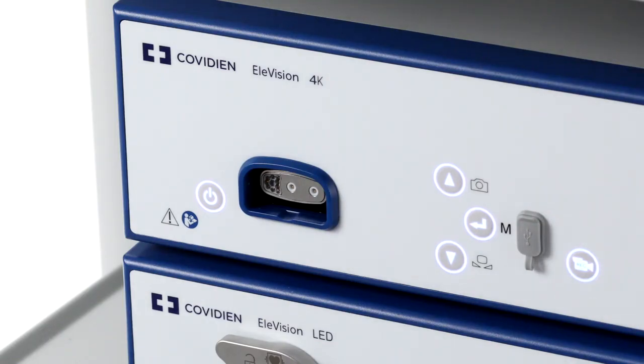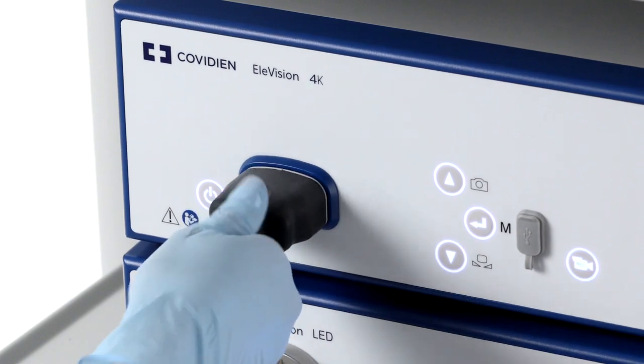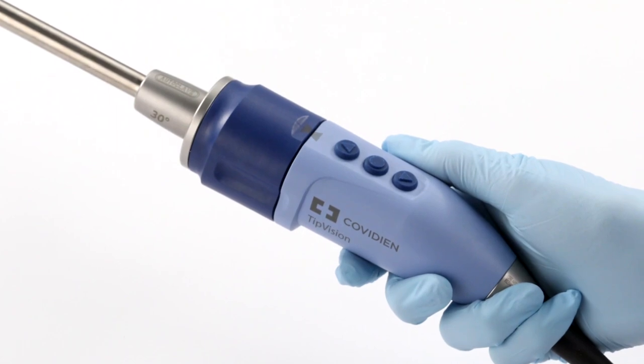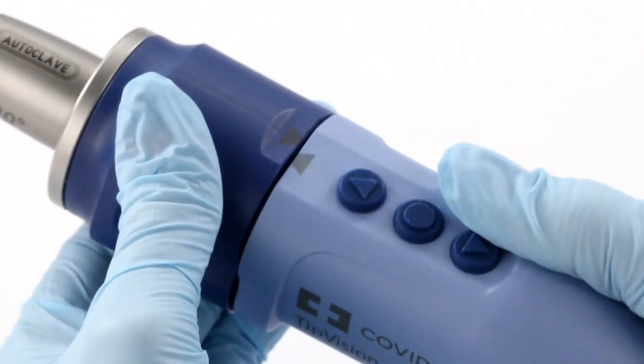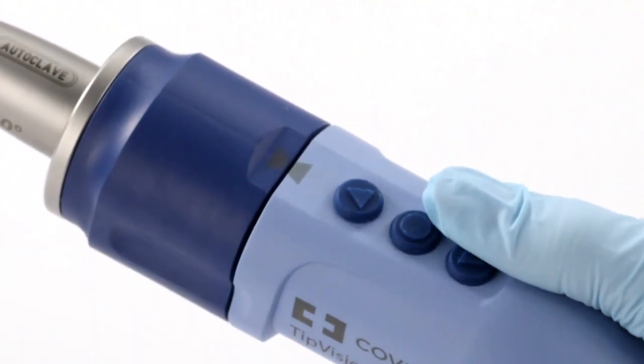To use tip vision, connect the video scope to the camera control unit by sliding the connector plug into the socket. When using 30-degree tip vision, turning the proximal end, which is the light blue section, should be used for horizontal orientation. The video scope is in its home position if the tips of the triangle indicators are facing each other.